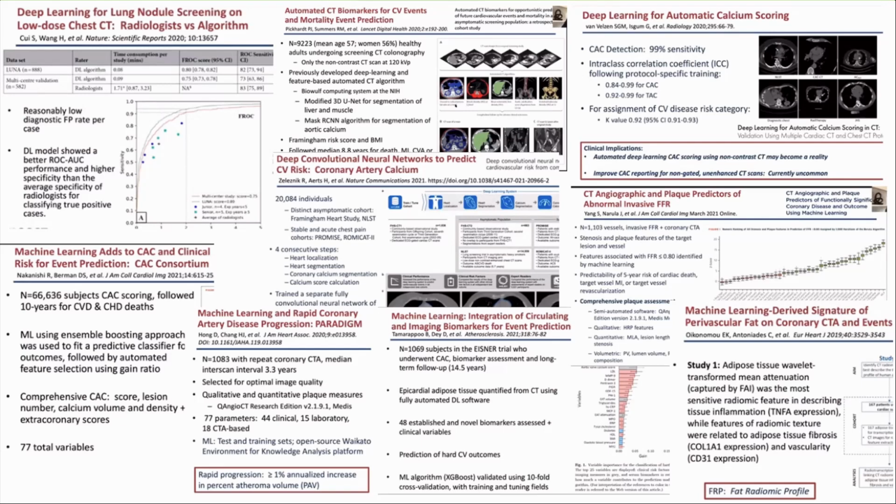We can even see how radiomics and analysis of perivascular fats on coronary CT can be used to predict mortality. We can see how techniques can quantify visceral fat burdens and all sorts of things that you would not think possible and would not have the time or feasibility to do with human cognition or human segmentation of the data.